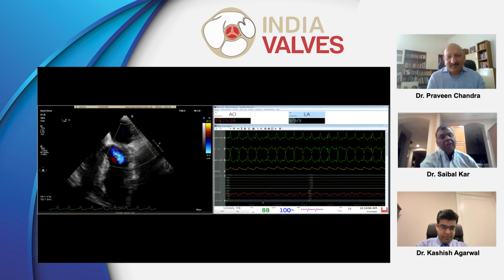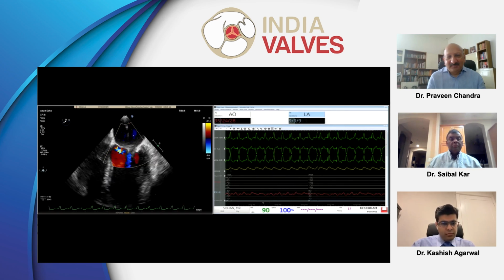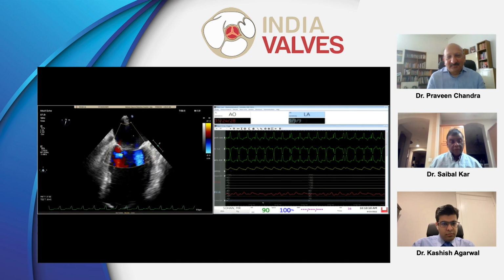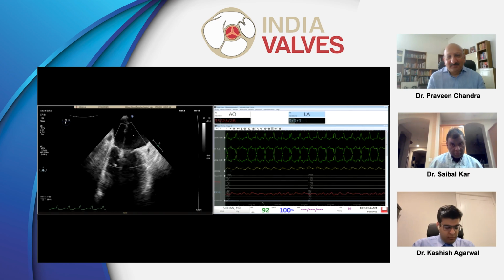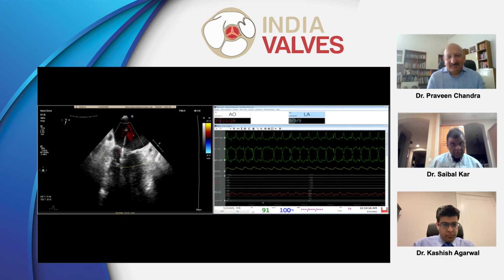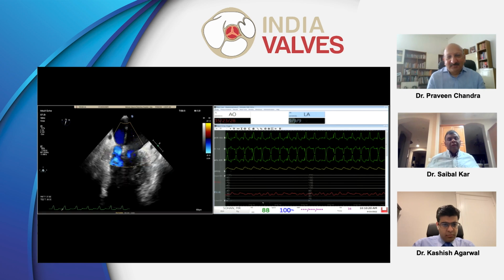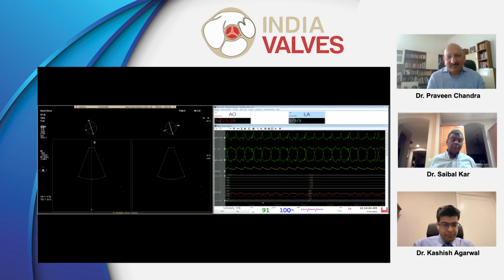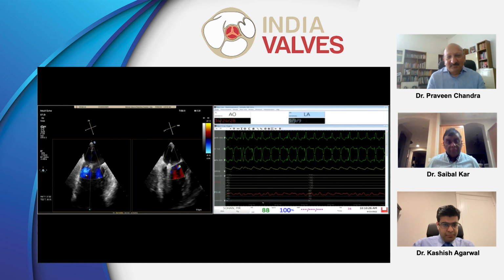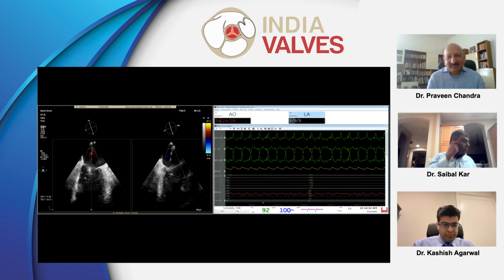Show me in the bicommissural view where the color jet's coming from. Go to the bicom. See, that's a commissural jet. See that? That doesn't matter. Great. The flail is actually taken care of. Very good. The anterior jet is gone. Now let's do gradients and pulmonary vein.